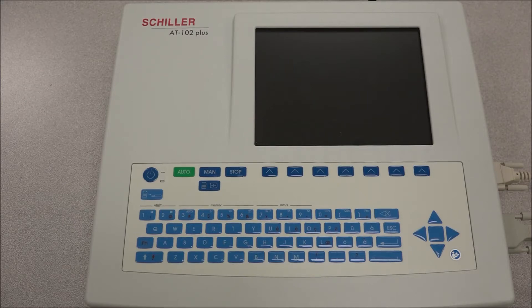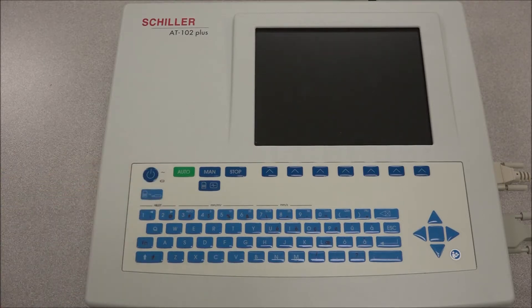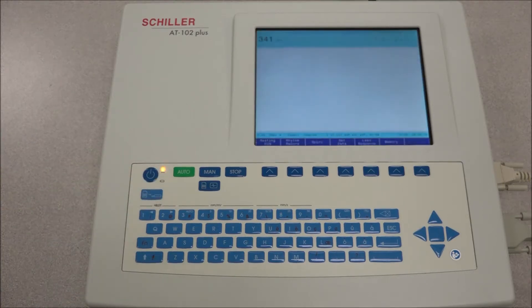To turn on the AT102 Plus, press the ON key. The visualization on the screen will vary according to the task that is being performed.